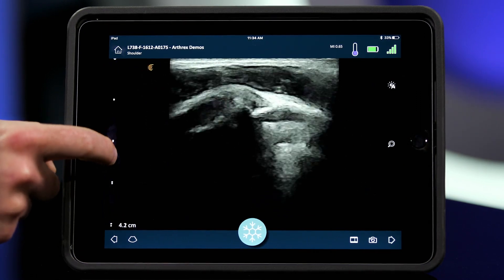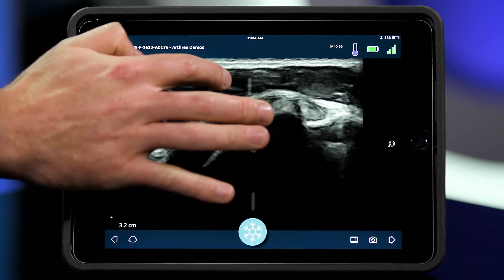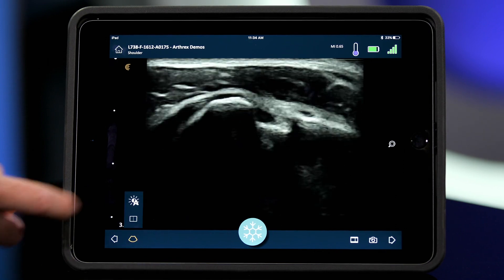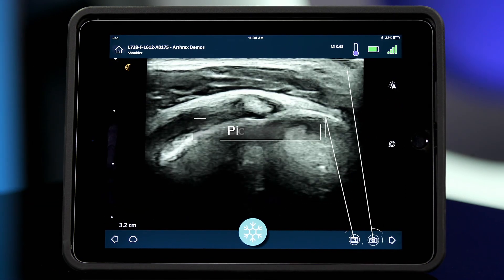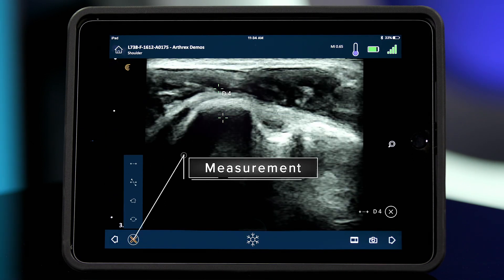Quickly adjust depth or gain to customize image quality based on patient anatomy, or allow the automated functions to optimize the image for you. Also snap pictures, videos, and use the measuring tool to verify anatomy.